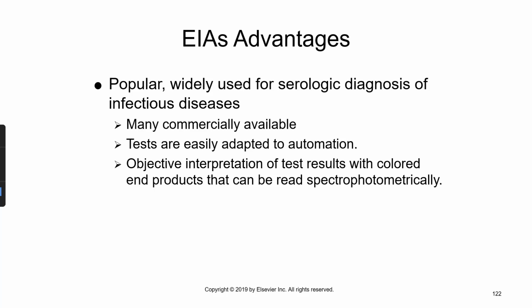Popular and widely used for serological diagnosis of infectious diseases. There's many commercially made kits available, and tests are easily adapted to automation. Objective interpretation of results with colored end products that can be read spectrophotometrically.